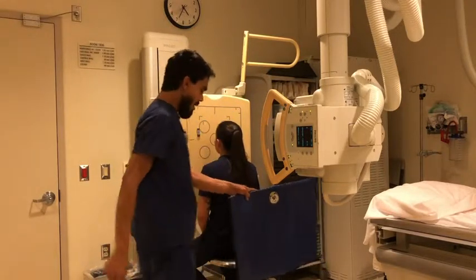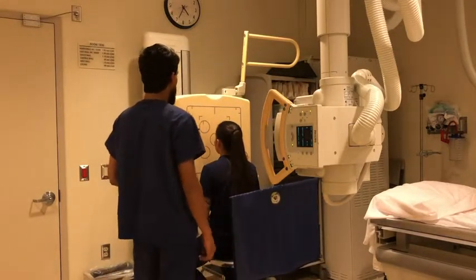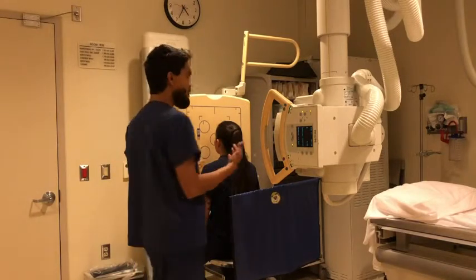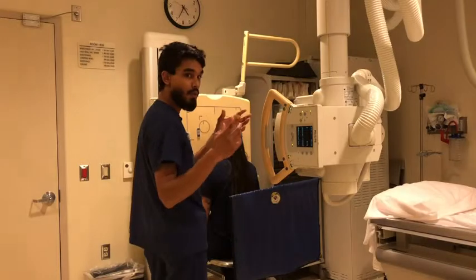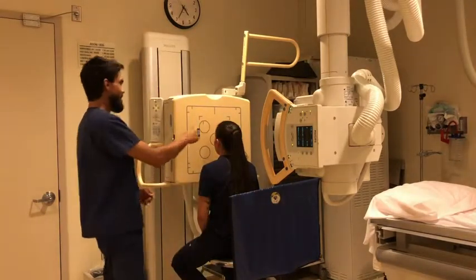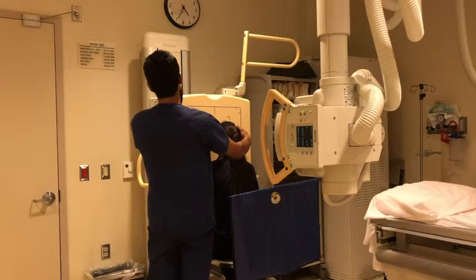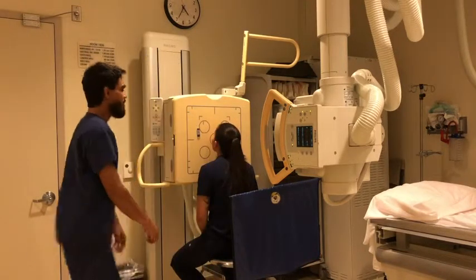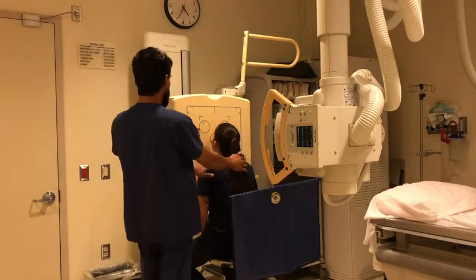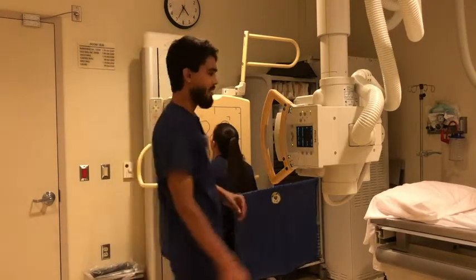So for this view, we want the OML to be about 15 degrees with the IR. Yeah, that looks good. Try to get your chin all the way up against the board there.